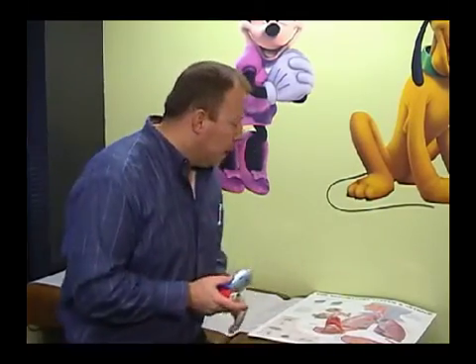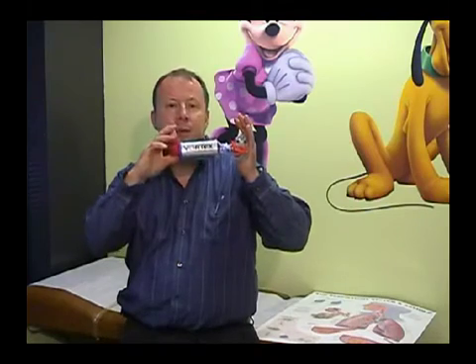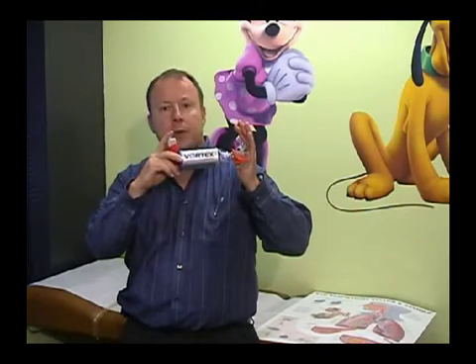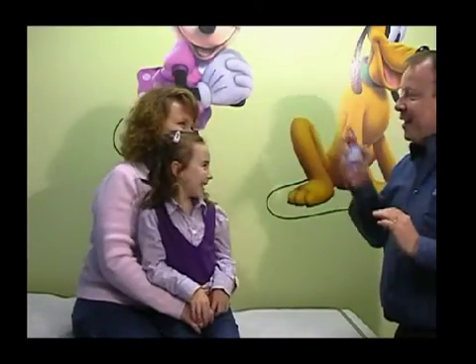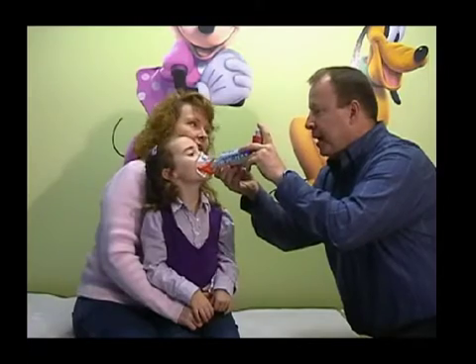Well, especially for a lot of the kids, they're not able to follow those directions completely, and so there are some modifications that we can do depending on how old they are. In a newborn, we've shown that we can deliver this just as well as the nebulizer forms, and what you do is shake it up good, put it on their face, puff it, watch them breathe in 6 or 8 times. That's one puff. With albuterol, you always wait a minute and then you do your second puff, and we usually do them in 2 puff groups.